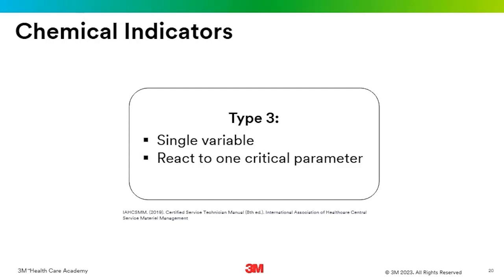But an example of this is in some labs, they have a pellet that they'll actually place, and it'll melt if the temperature is right, like if the temperature is what's needed to melt it. So again, we don't really use it too often in healthcare or in the sterile processing department, but in some labs, they'll use melting pellets to demonstrate that whatever they're testing gets to the right temperature to melt that pellet.